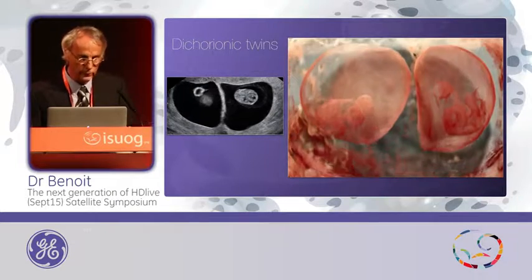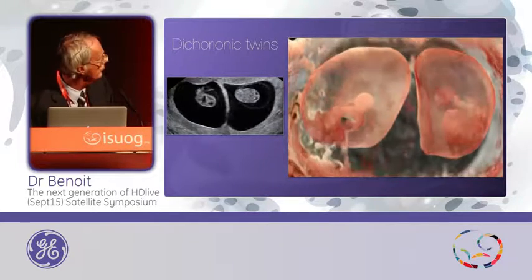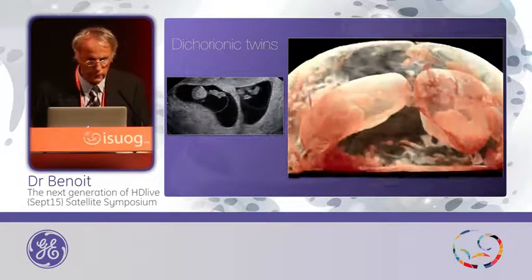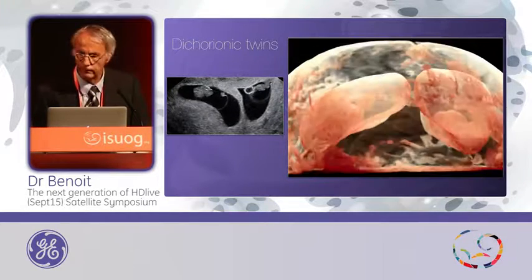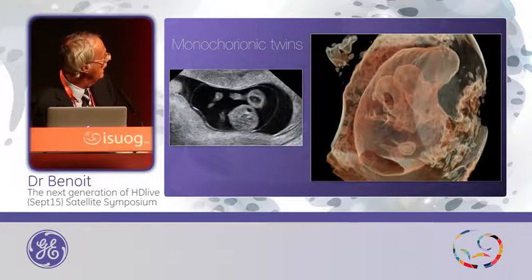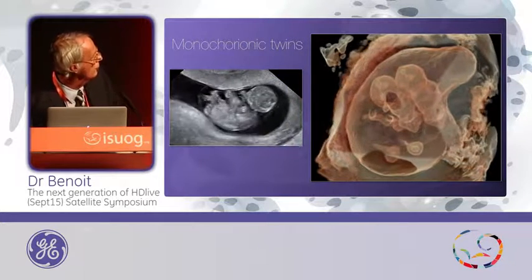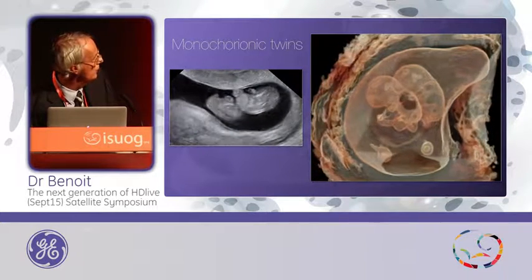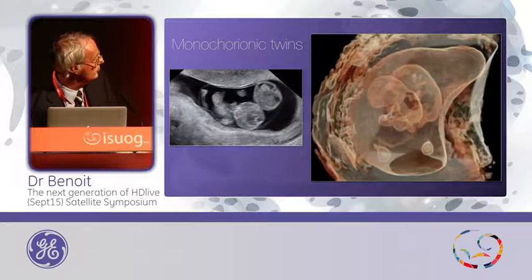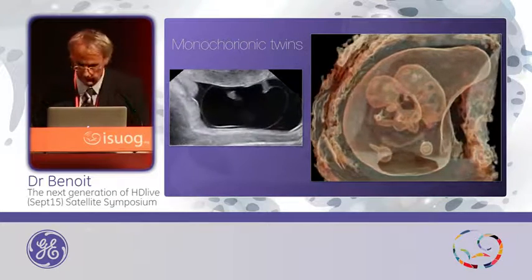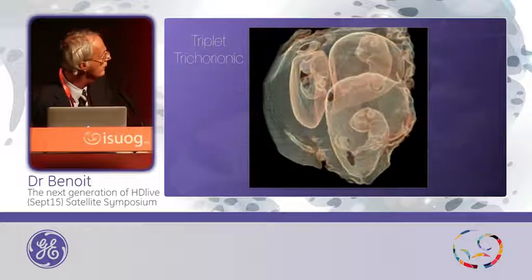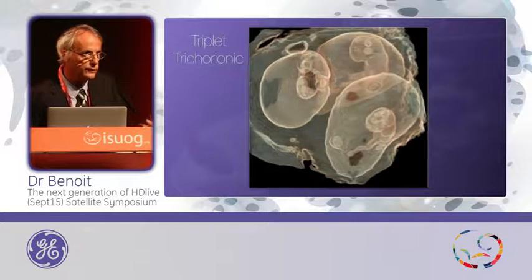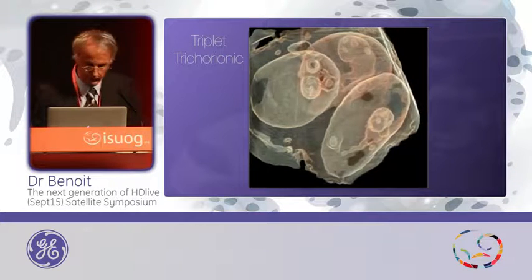I really like to use this in cases of twin pregnancy, because twin pregnancy makes it difficult to provide good 3D images. In this case, we choose a volume without cutting the volume, and this is the result with silhouette mode. This is another one — a monochorionic twin case, also monoamniotic twins, where you can clearly see the two embryos. For triplet, it's really difficult to give a 3D picture, but if you play with the silhouette and transparency, you can obtain this.